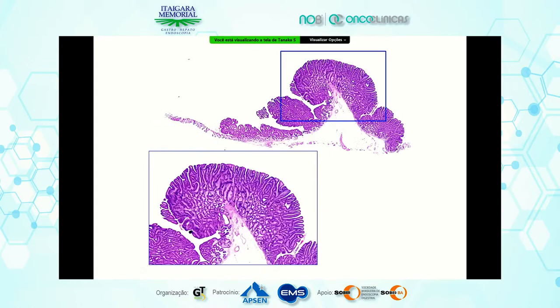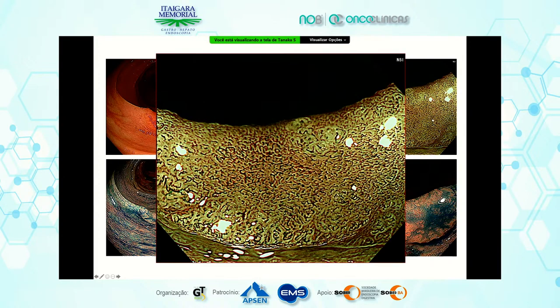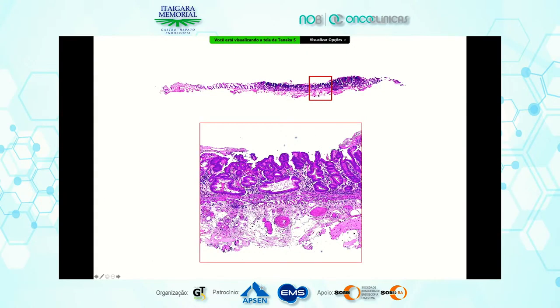This is a typical adenoma. Also, this is a flat region. How do you diagnose? Vessel pattern and surface pattern are both a little irregular. So we diagnose this as type 2B, JNet type 2B. This is an ESD specimen, intramucosal carcinoma.